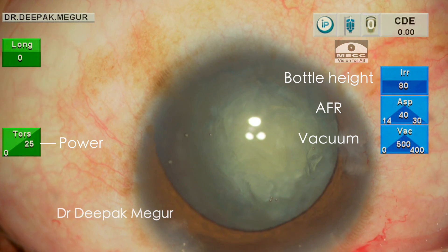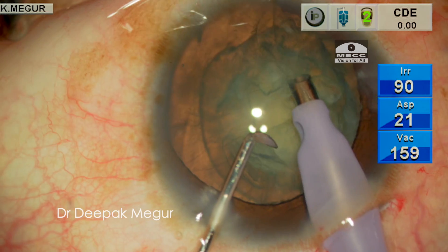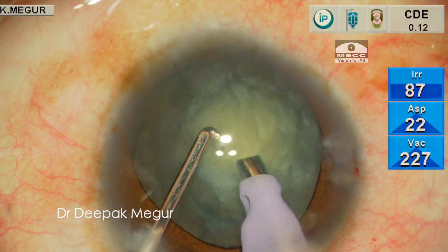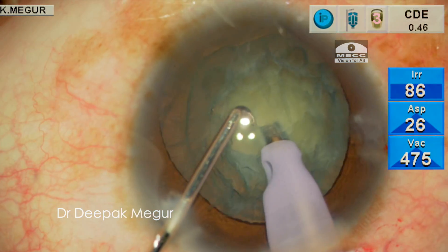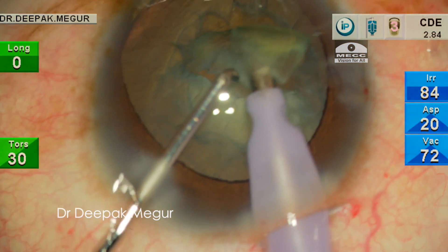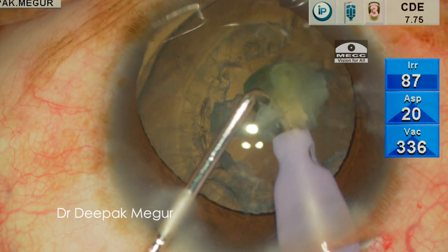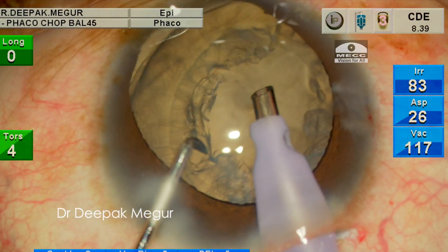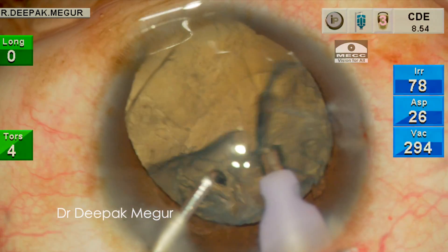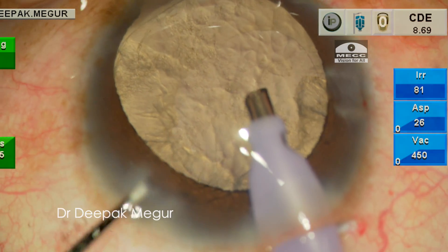These are my settings. I have lowered the bottle height a little bit from what I usually use. In this case the phaco part is probably the easiest one. The nucleus is of ideal grade and could be easily chopped. I bury the phaco tip and perform the vertical chop. The nucleus is then broken down into smaller fragments and aspirated quite easily. Then the epinucleus is also aspirated safely, and before removing the phaco handpiece I inject OVD to prevent sudden shallowing of the anterior chamber.